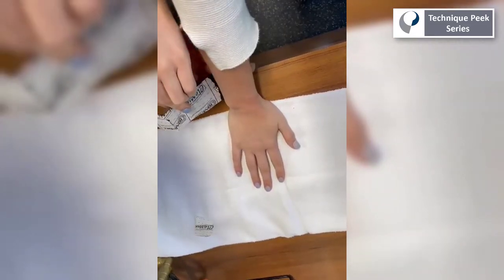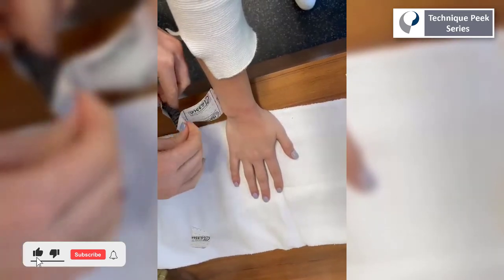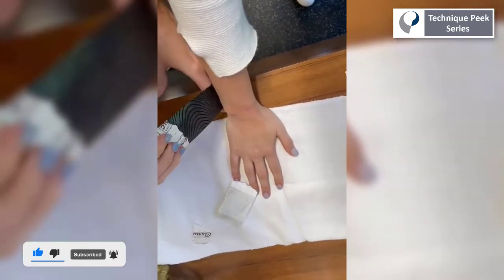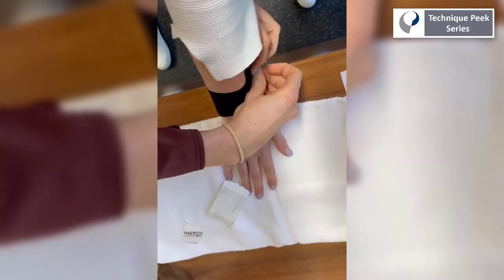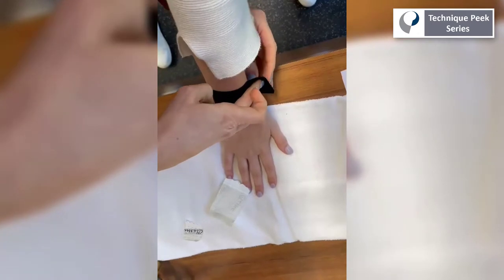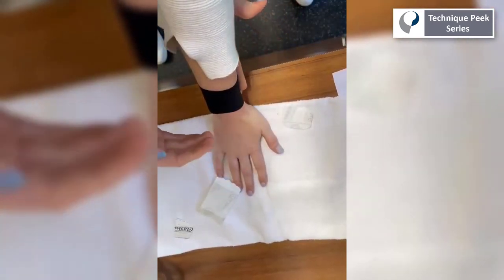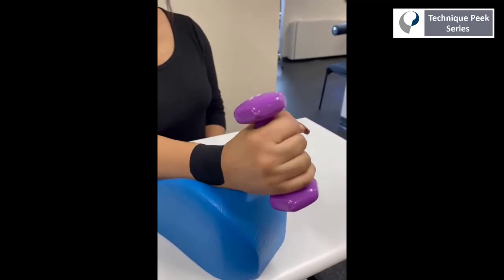Today we're going to discuss a kinesiotaping technique called EDF — Epidermis Dermis Fascia. The benefits of using this technique include decreasing pain by affecting neural tension so that the skin and scar are not strangling the nervous system. It facilitates homeostasis, decompression of a painful area, provides proprioceptive input, and enhanced motor responses.